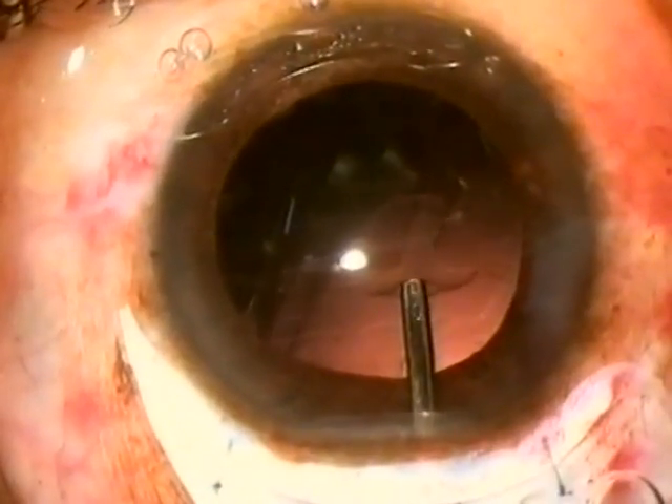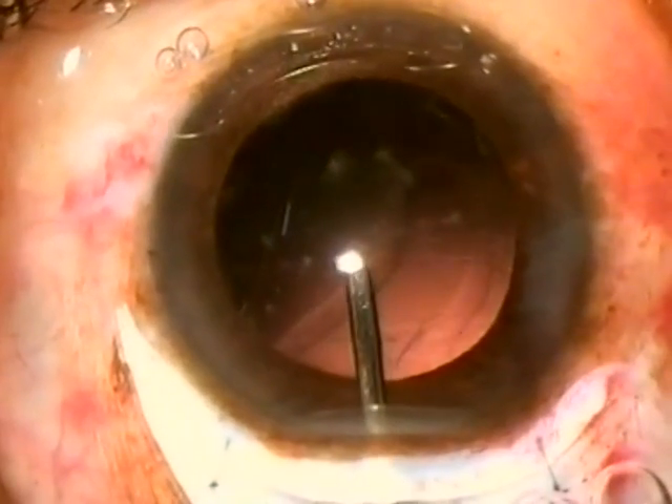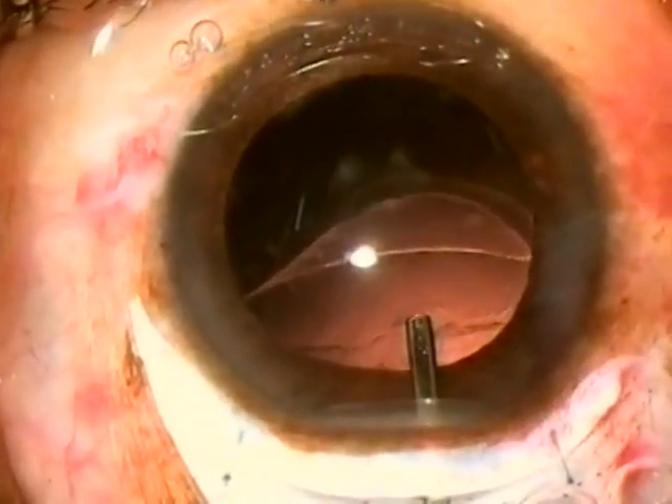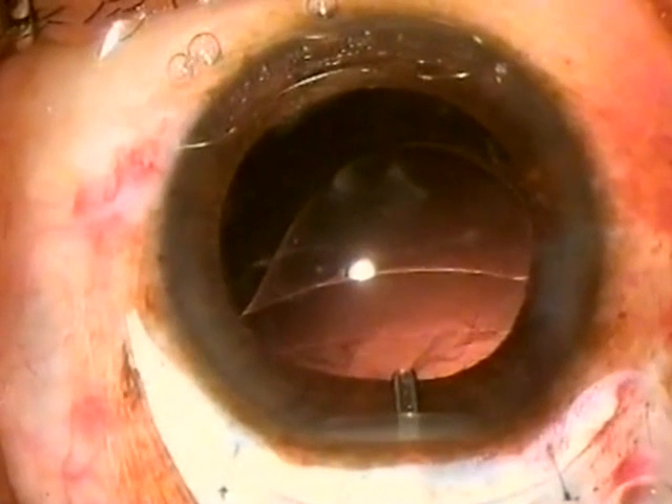A viscoelastic substance such as methyl cellulose can be injected into the eye before the implant is inserted. Viscoelastic makes the surgery safer and easier. HPMC — Hydroxypropyl Methyl Cellulose — is readily available.